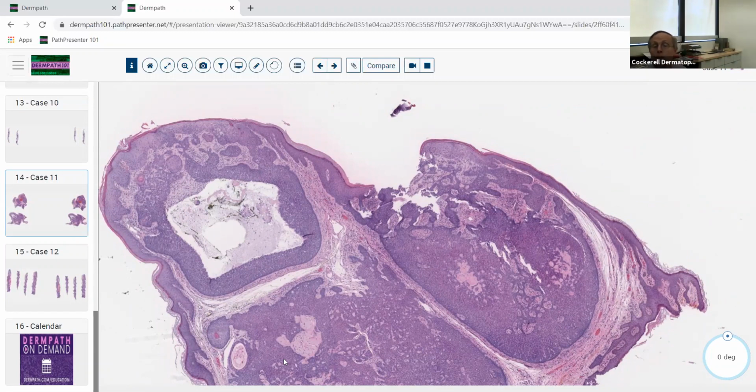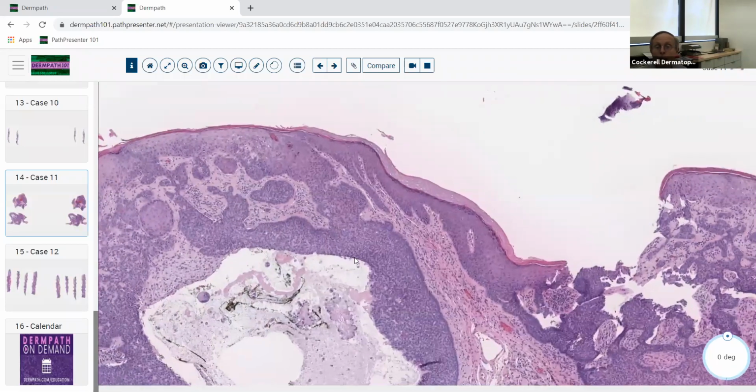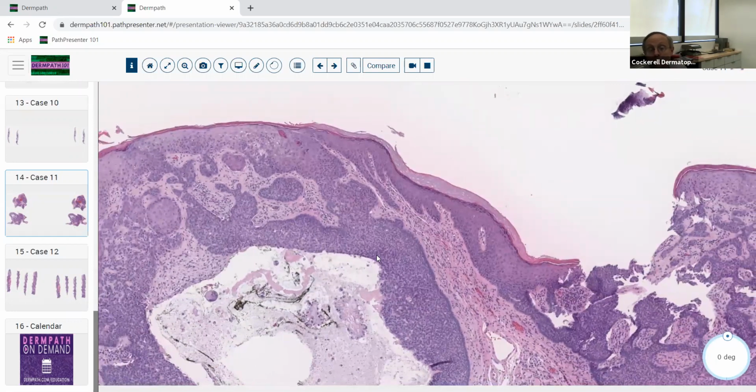So just don't be surprised if sometimes you biopsy kind of an ulcerated fungating lesion on the groin of someone that it comes back as something like a trichoblastic basal cell. Sometimes you see even lesions that are comprised of only this type of morphology, and it may not have any contiguity with the epidermis at all. Just had a case the other day from a clinician who called me in disbelief because he thought it was a cyst. And when he biopsied it, it showed the same kind of morphology. It wasn't really a cyst at all. It was more of this basal cell carcinoma with this trichoblastic morphology.